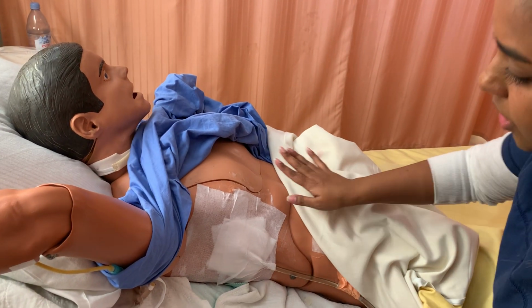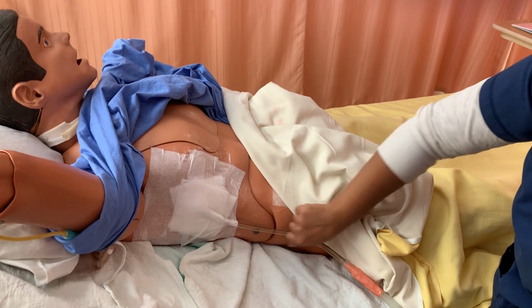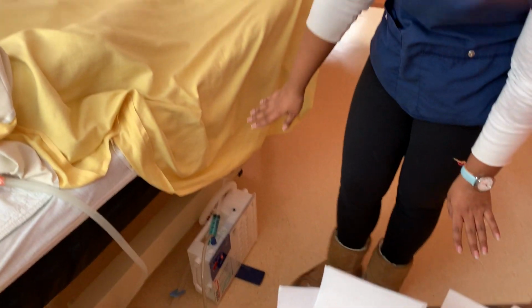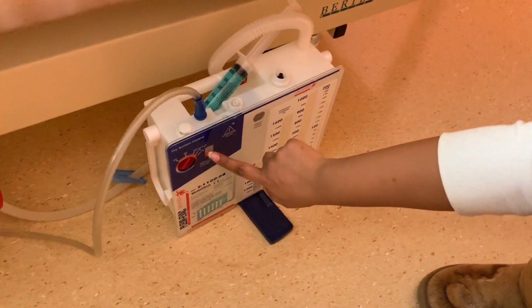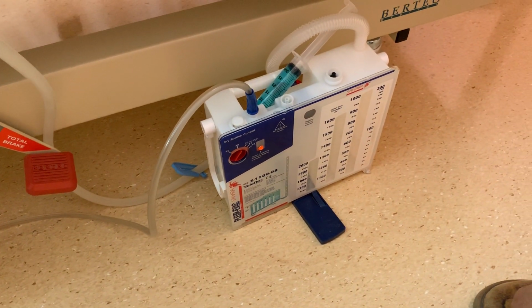Is that okay? Good. So as you can see, this is a completely occlusive dressing. The tube is tented. There's no dependent loops. There's no kinks in it. It looks good. We're going to follow it down to the collection chamber. So it's set to the correct suction that the doctor has ordered. We see the orange ball there. We know that it is suctioning.